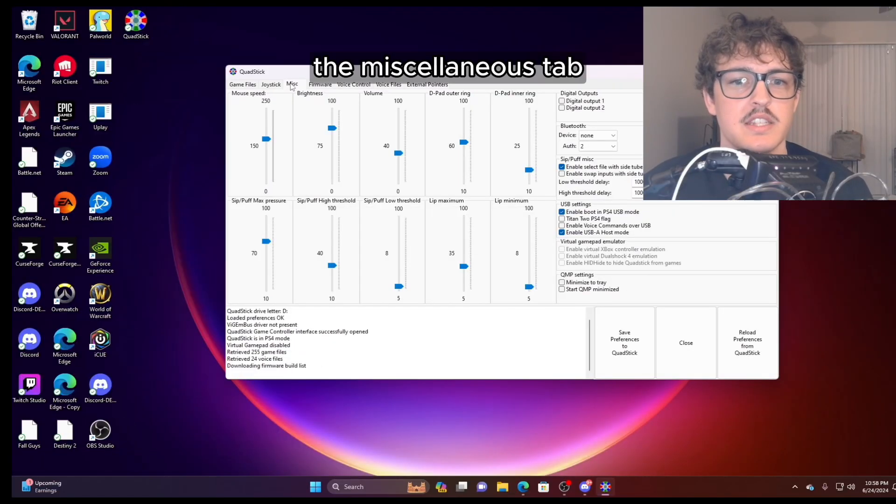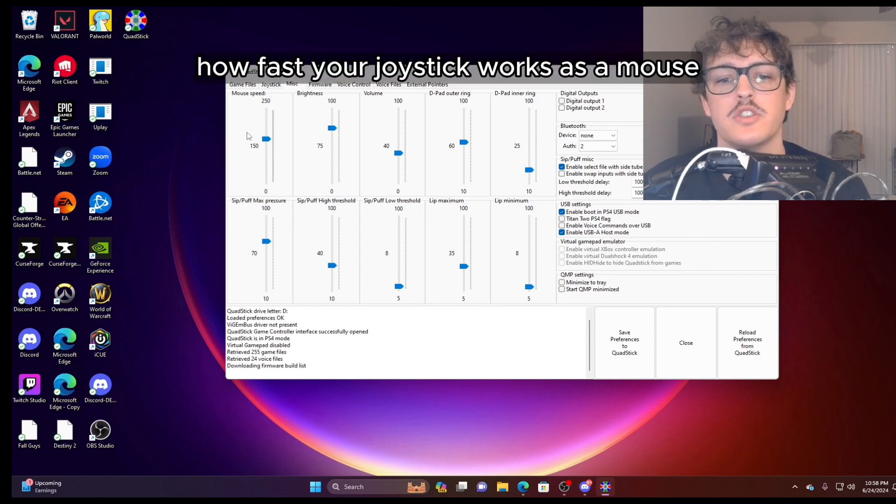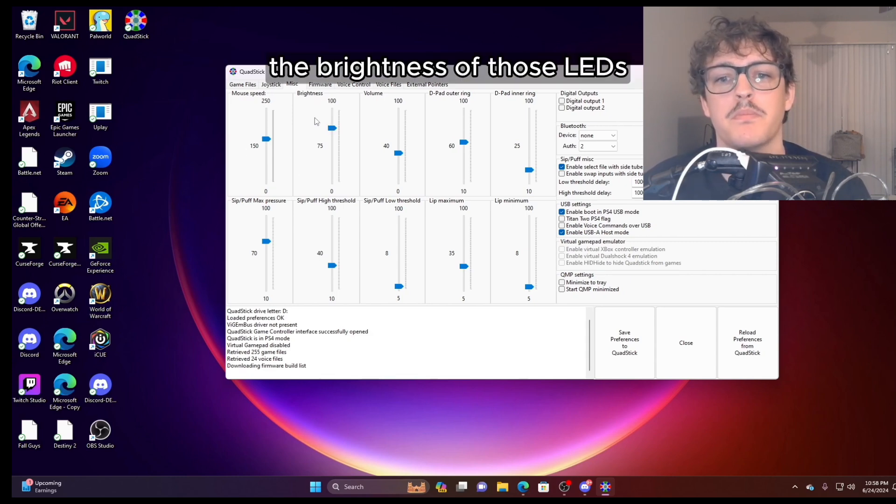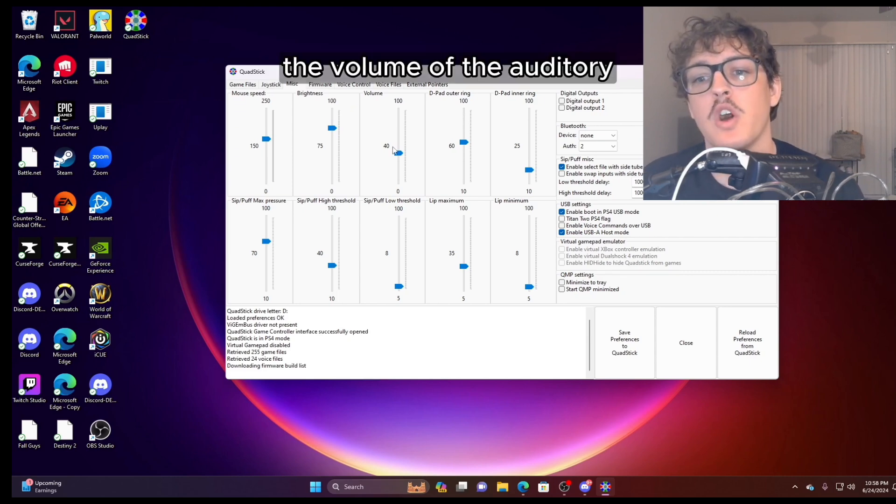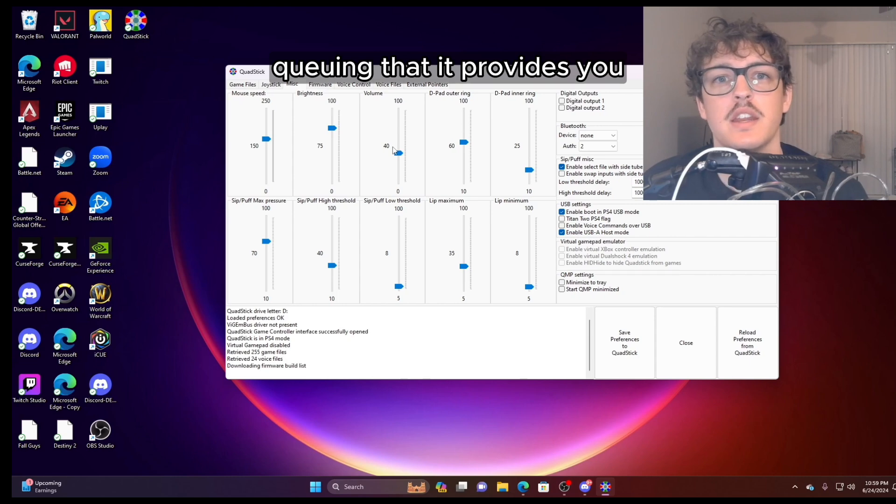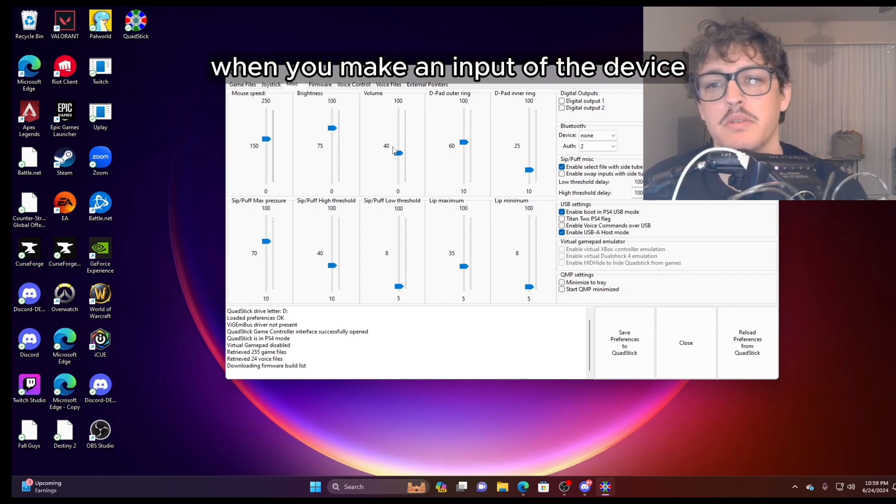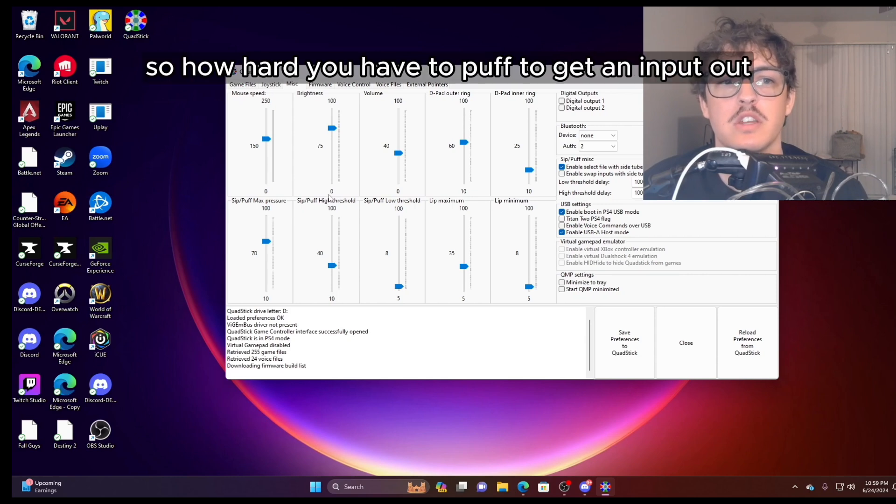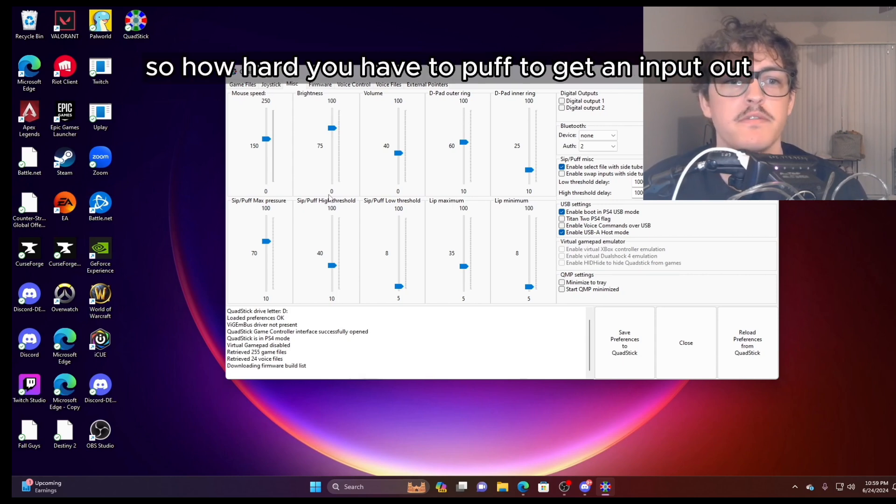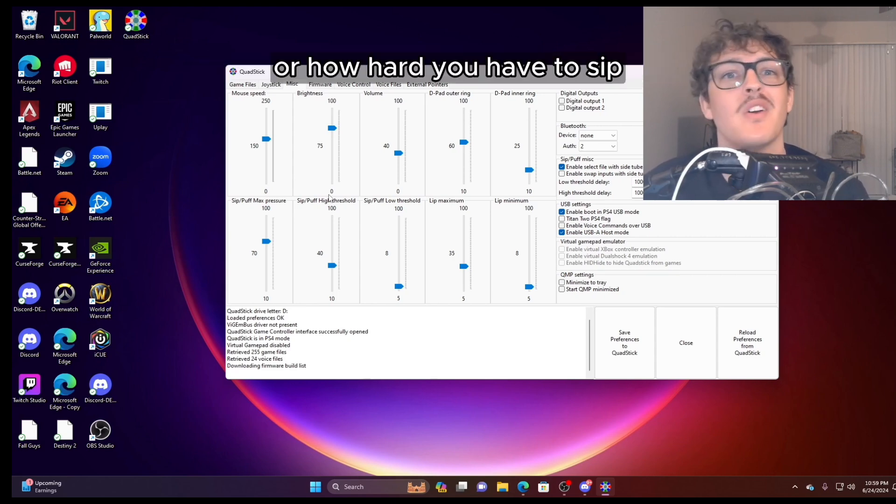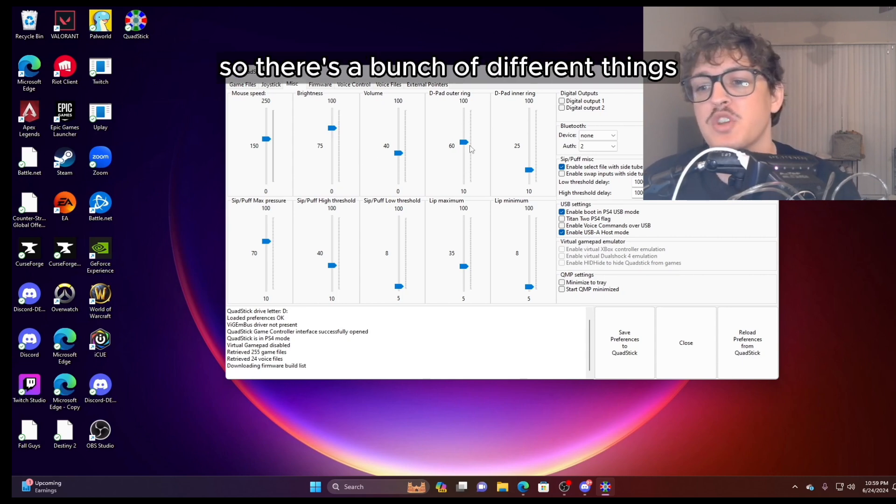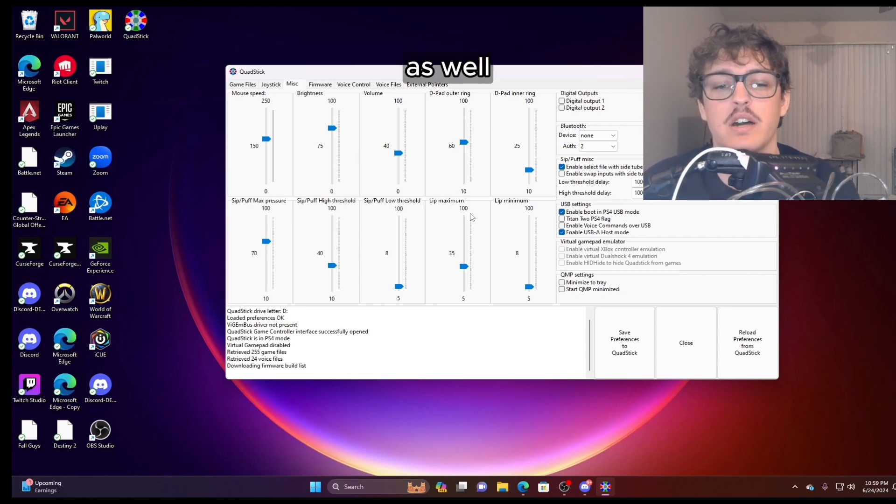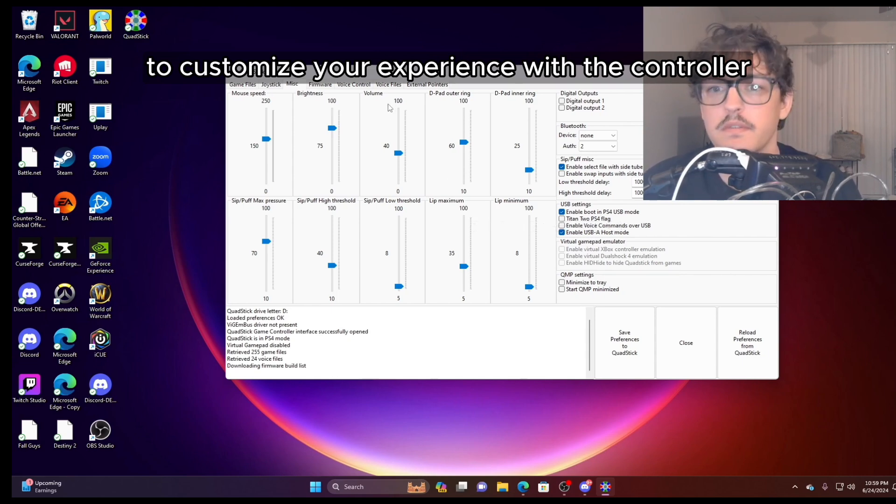The miscellaneous tab. You can control how fast your joystick works as a mouse via brightness of those LEDs on the QuadStick controller, the volume of the auditory cueing that it provides you when you make an input of the device, your sip and puff thresholds. So how hard you have to puff to get an input out or to provide an input to the controller, or how hard you have to sip, or how light you can sip to get that same input. So there's a bunch of different things you can do in these settings as well to customize your experience with the controller.